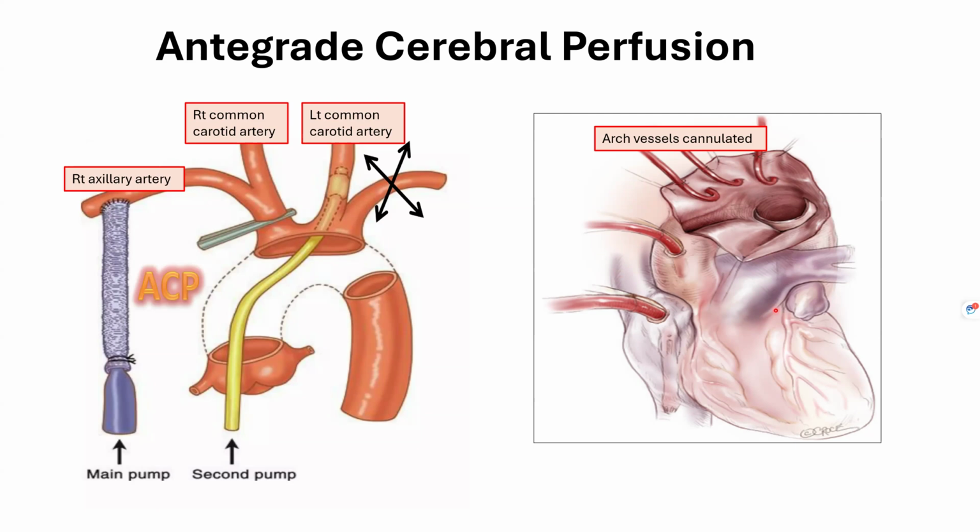So as I mentioned, this is very sensitive. These are all sensitive vessels, because there are chances of causing a tear or injuring the arch vessel. If your pressure is too high, you can even damage the brain cells.